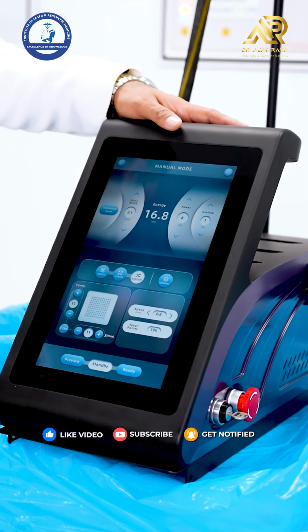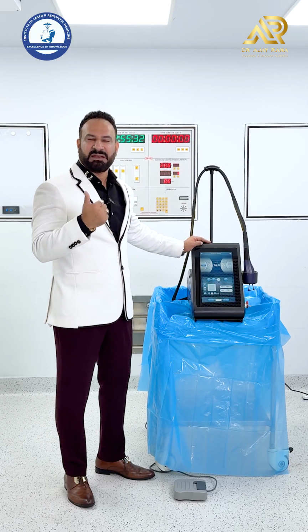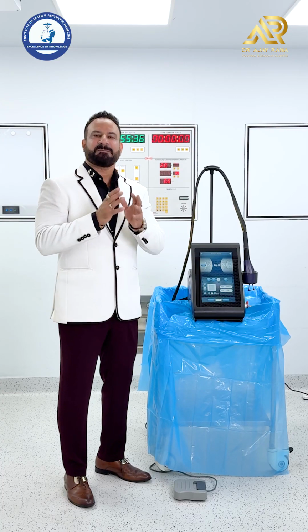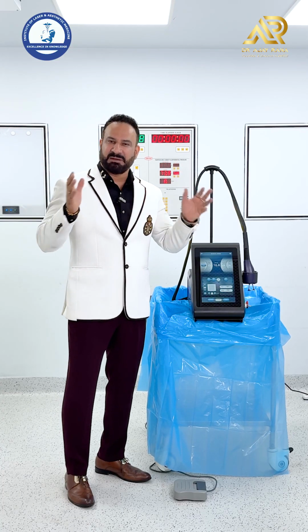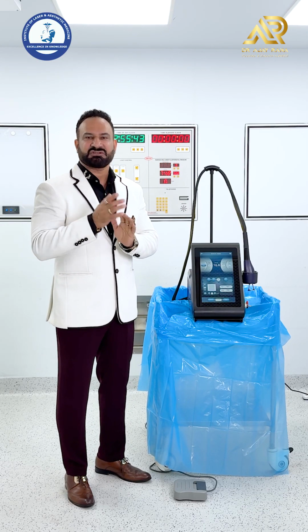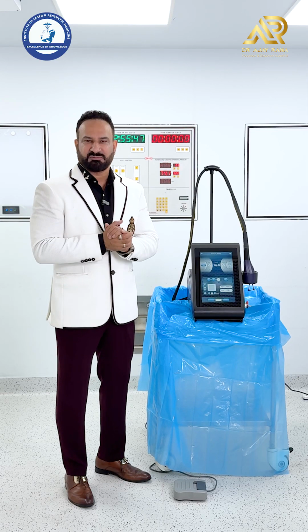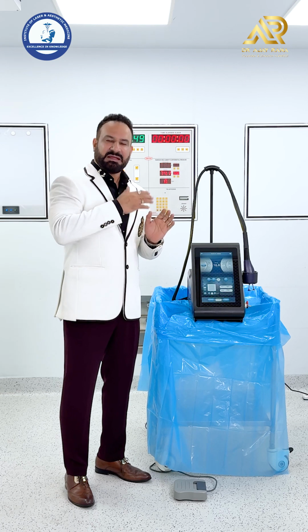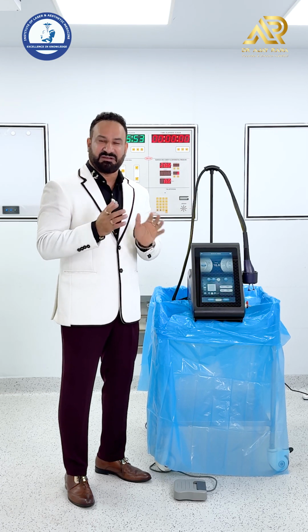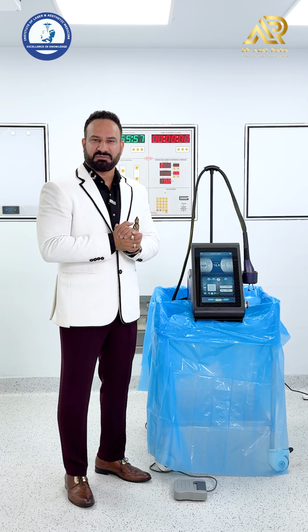configuration. You will see the wavelength, which is 1927 nanometers. It is a non-ablative platform. I'm sure you remember from our previous videos, fractional lasers are either ablative or non-ablative. The main ablative laser is erbium YAG, 2940 nanometers, which is very strongly absorbed by the chromophore water, followed by carbon dioxide. 10,600 nanometers is the wavelength, which is actually 20 times deeper penetrating than erbium YAG.